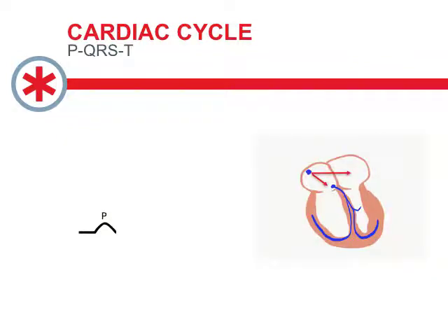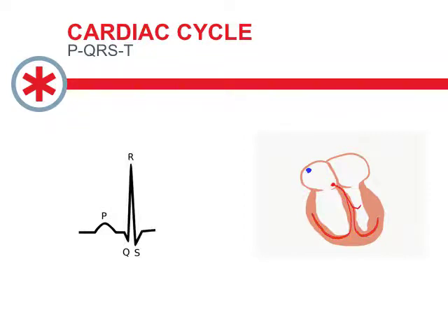So how does this relate to the waves that we see on our electrocardiogram? Well, I think you know the first step is atrial depolarization, and that, of course, is the P wave on our electrocardiograms. And that pause that we see at the AV node is actually the PR segment. So we talk about that when we talk about intervals a little later on. But basically the atria have contracted and now there's a pause. So that pause is basically that flat line you see on the ECG tracing between the P wave and the QRS complex. So the ventricles now fire, and that gives us our QRS complex, as you see here.